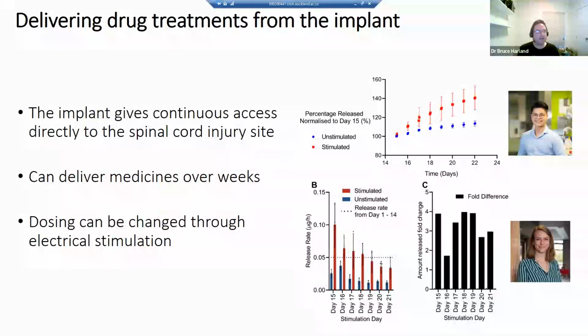Another type of technology we're looking at is conducting polymer. This is more of a metallic structure that we could place on the implant, and we're able to incorporate a hydrogel inside of it. Then when you electrically stimulate the conducting polymer, you would be able to control the release of portions of hydrogel, which themselves can slowly release drugs over a period of a week. So using a combination of these technologies, we may be able to release drugs for an even longer period than a week. The idea is to develop these things and then find a way to put them onto the implant, and then we would be able to try combination treatments of electrical field as well as drugs such as neurotrophins, which have been shown to be effective at enhancing regeneration after spinal cord injury.